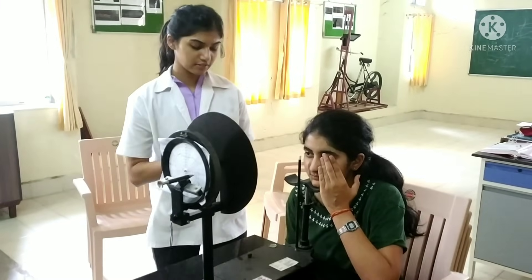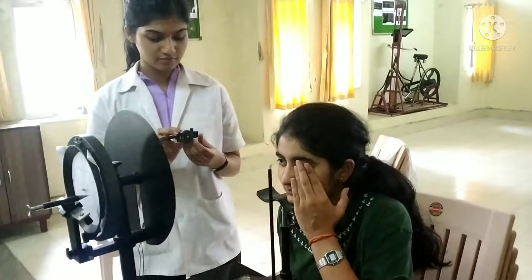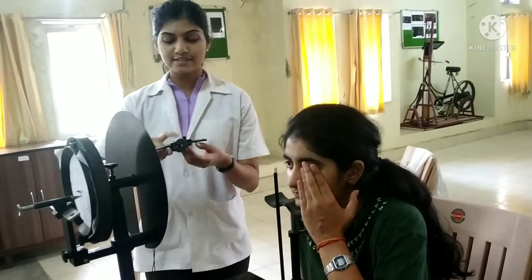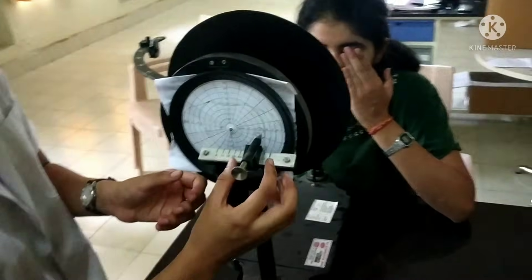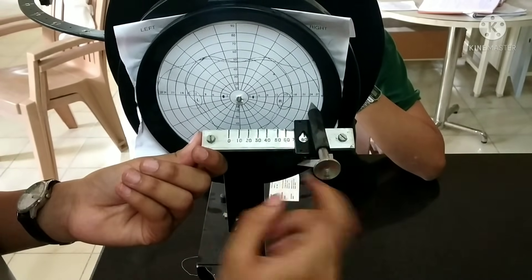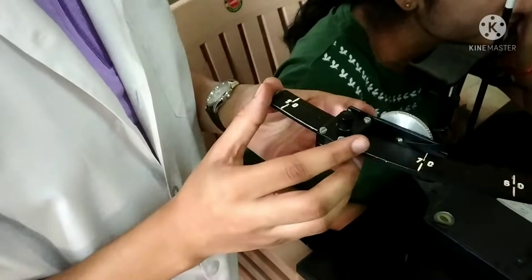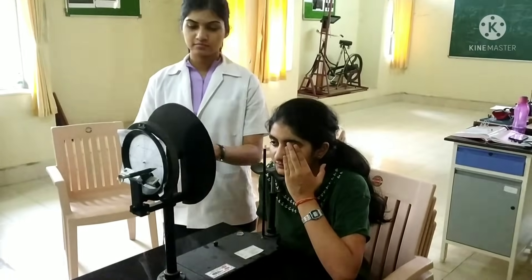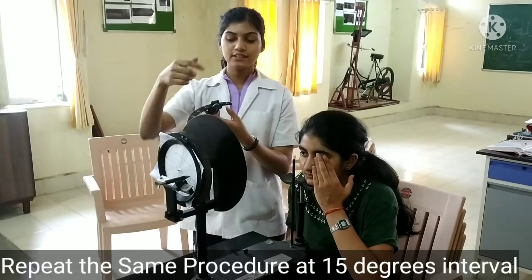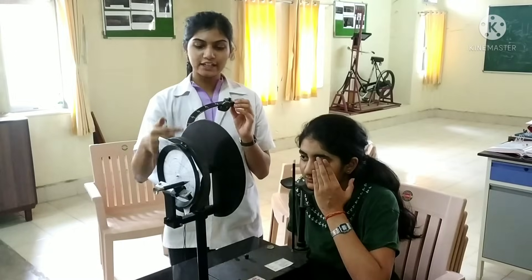The subject is instructed to raise her hand when the white object becomes visible. Our first reading is 80. We will mark the point for 80 on the chart. We have to repeat the same procedure at an interval of 15 degrees to mark all the meridians, moving from the periphery towards the centre.